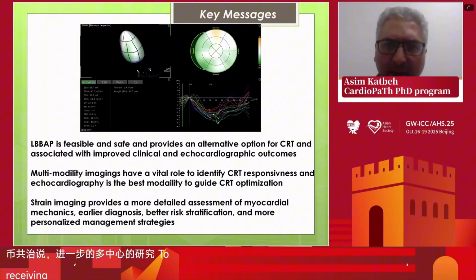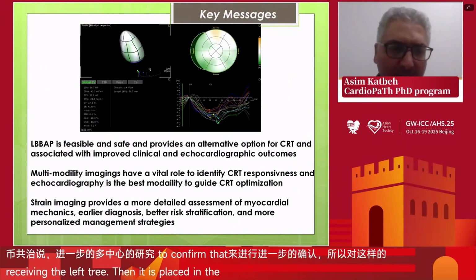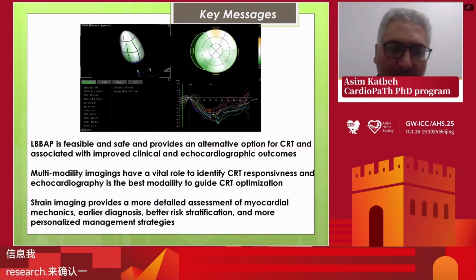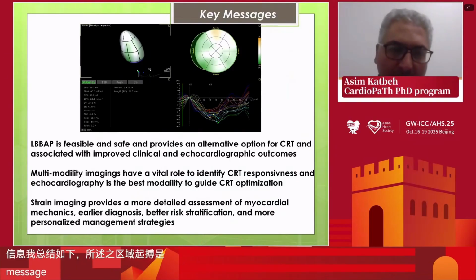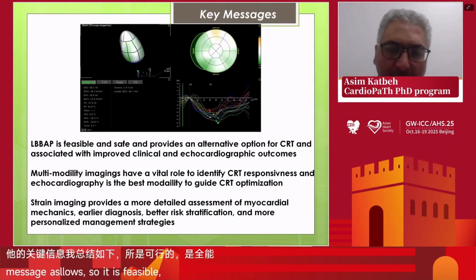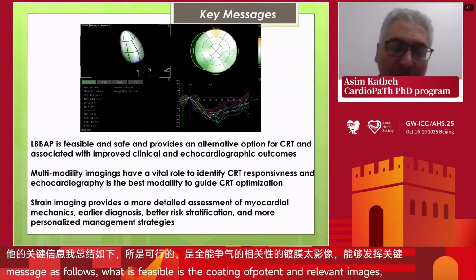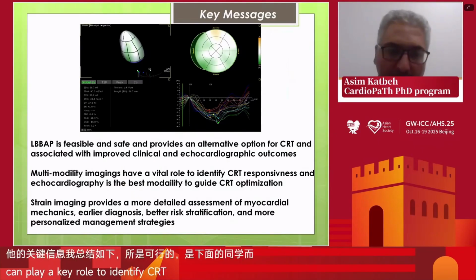The key messages of this presentation, I would like to summarize. The left bundle branch area pacing is feasible and safe and provides an alternative option for CRT, associated with improved clinical and echocardiographic outcomes. Secondly, multimodality imaging has a vital role in identifying CRT responsiveness, and echocardiography is the best modality to guide CRT optimization.